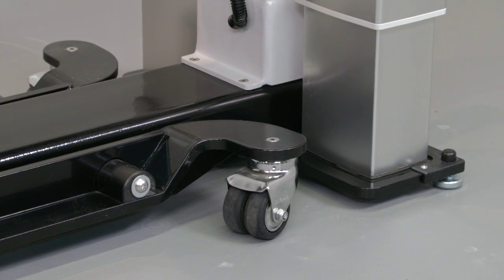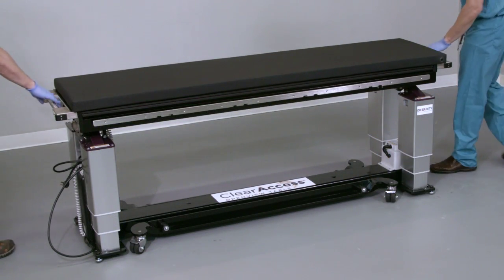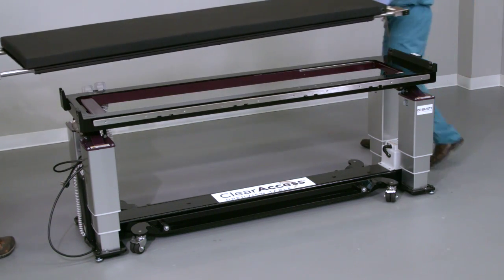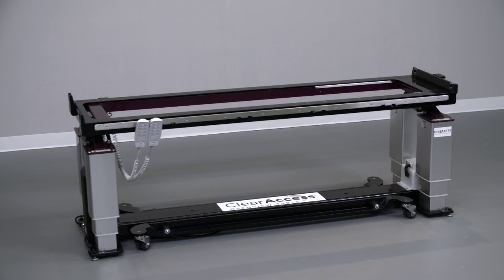If the prone platform is not already installed, it's likely that the supine platform, or flat top, is in place. If this is the case, remove the supine platform by grasping the silver handles at both ends of the table. Extend the handles by pulling outward, then lift and remove the supine platform from the Clear Access table base. Next, install the prone platform, or open top, onto the table.